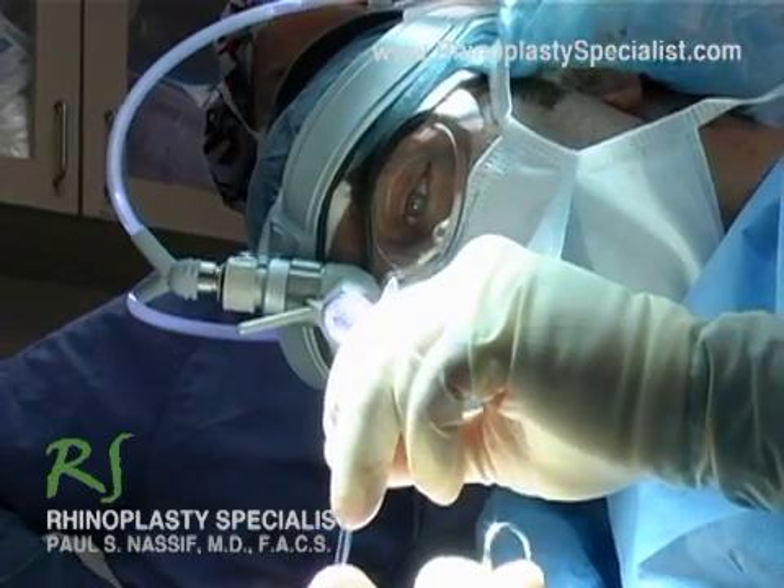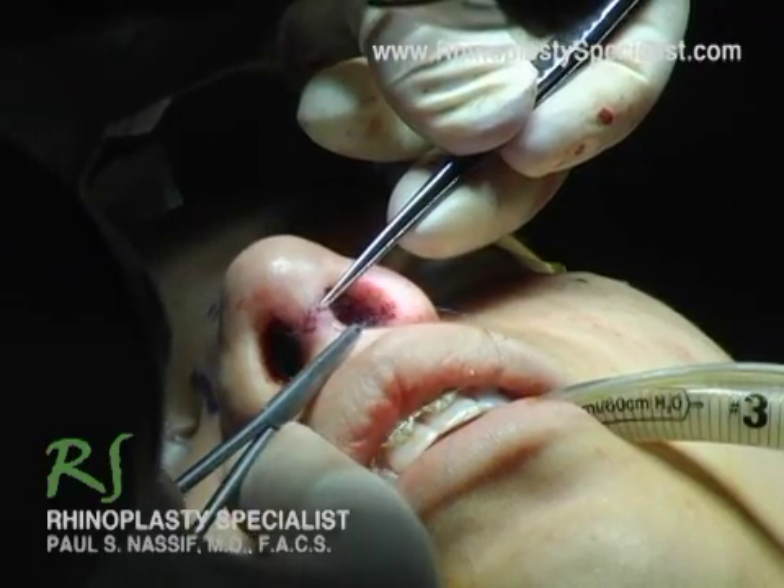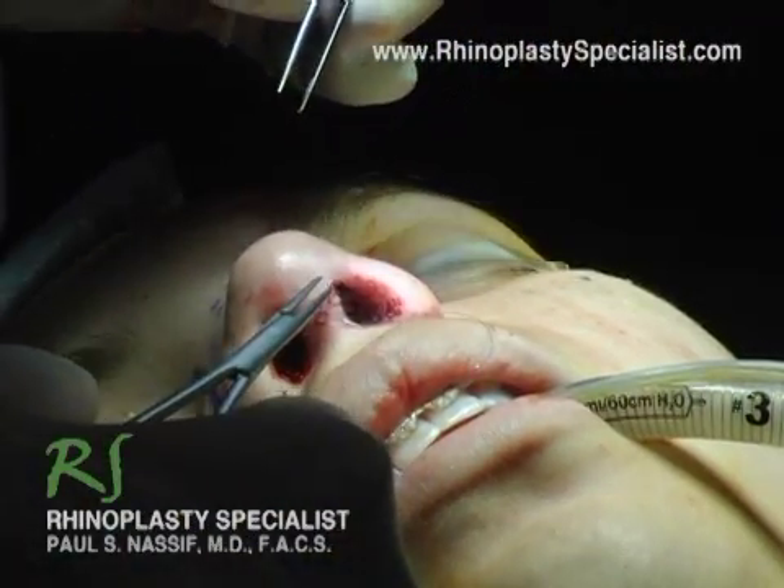One of the things we have to be careful about is that the edges of this wound that I'm closing fit absolutely perfect together so that you will not see a scar.